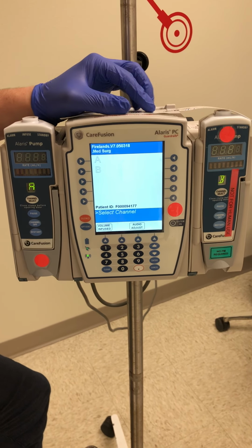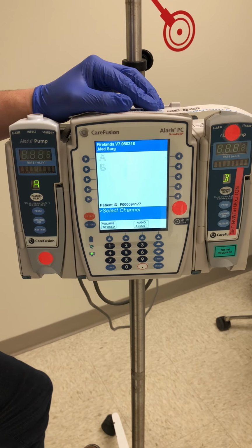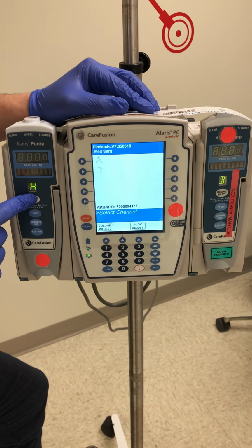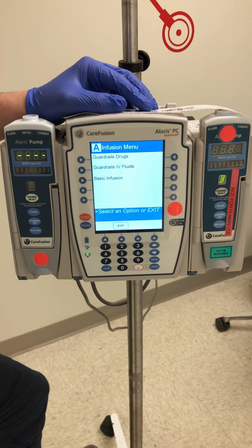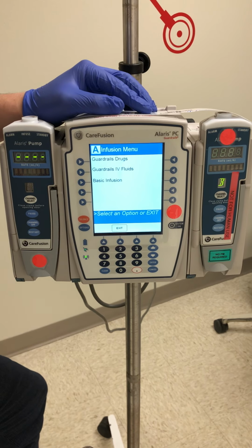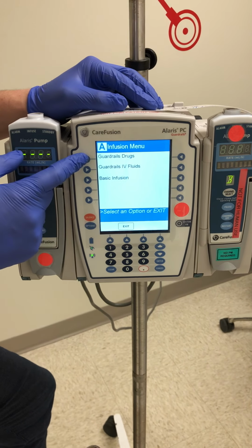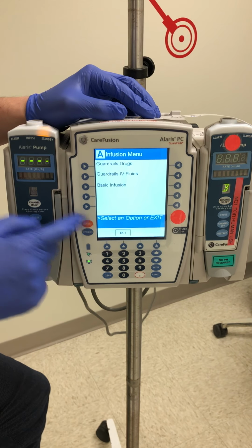So to hang a primary line, I want to make sure I select the channel first, and I will click channel select. You're going to notice then channel A infusion menu is provided and channel A is blinking. 3 options here. You have guardrail drugs, guardrail IV fluids, and basic infusion.